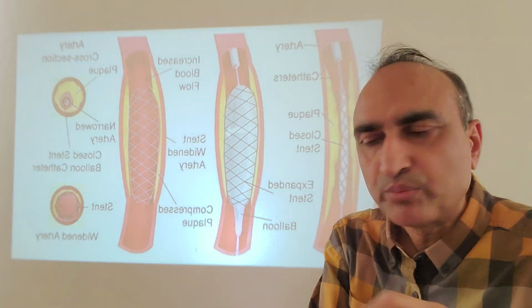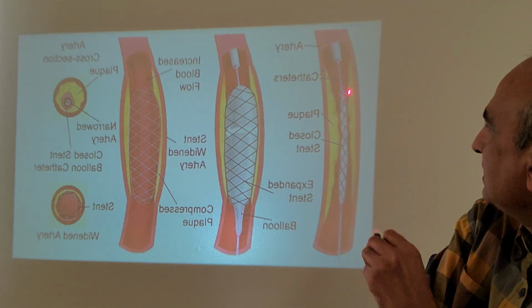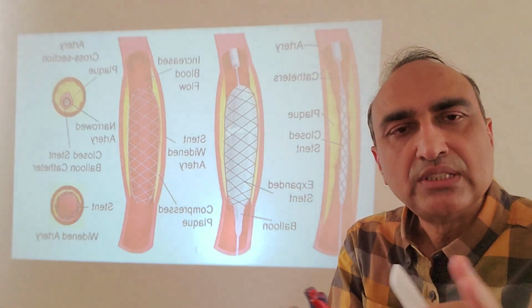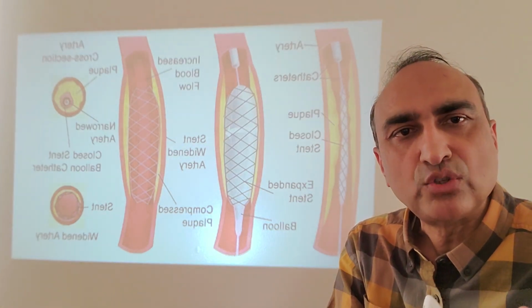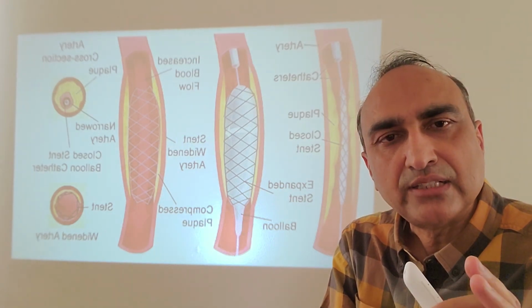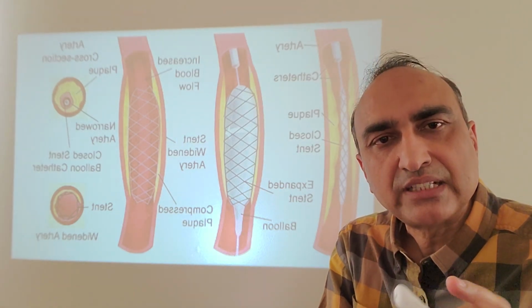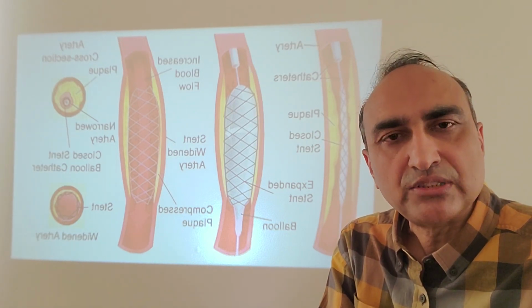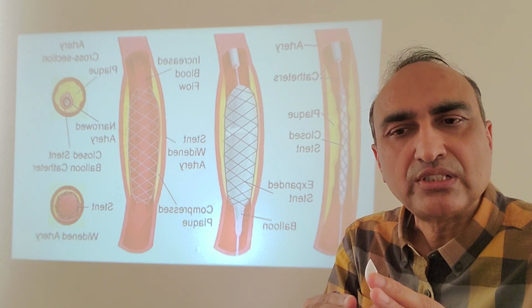Sometimes before you put the stent there, you have to clean the vessel a little bit with the balloon alone. So this actually takes care of some of the atheroma or plaque itself. So the stent and the balloon together can go easily. Once that happens, then the rest of the job is mostly easy, and we can actually restore the flow.